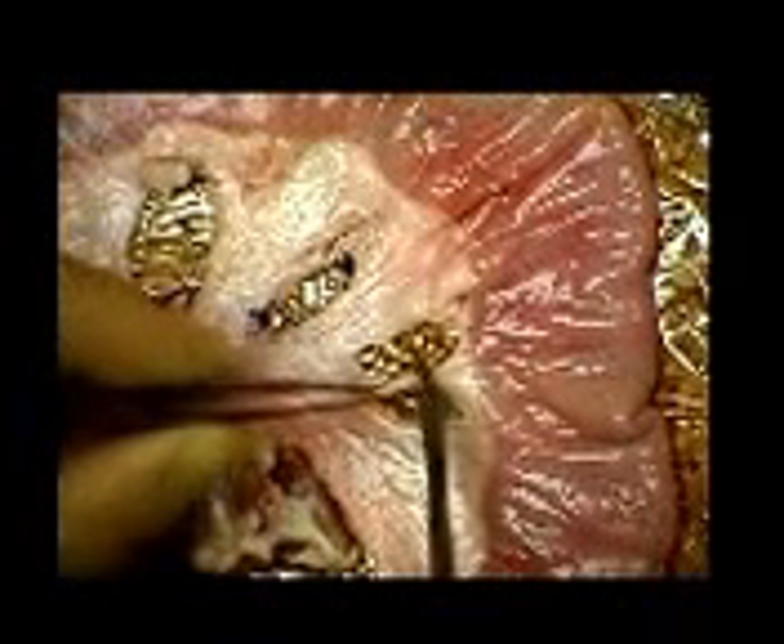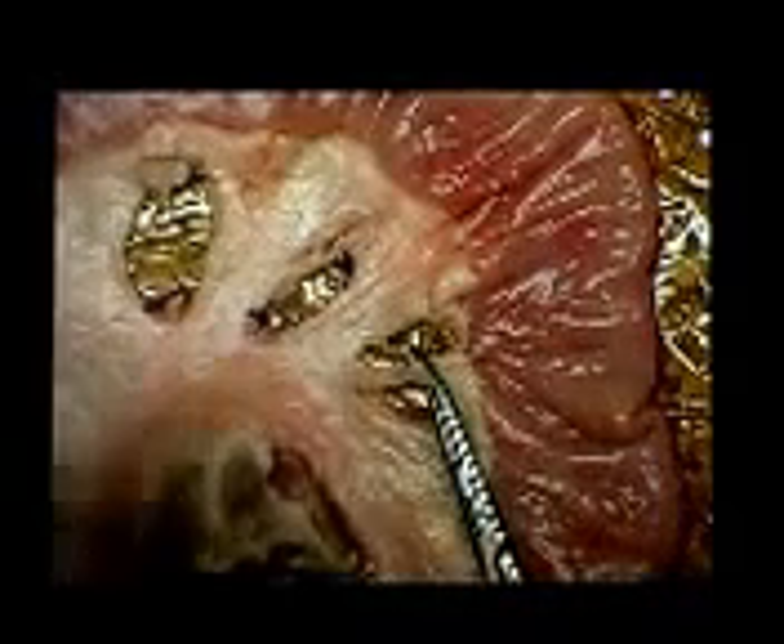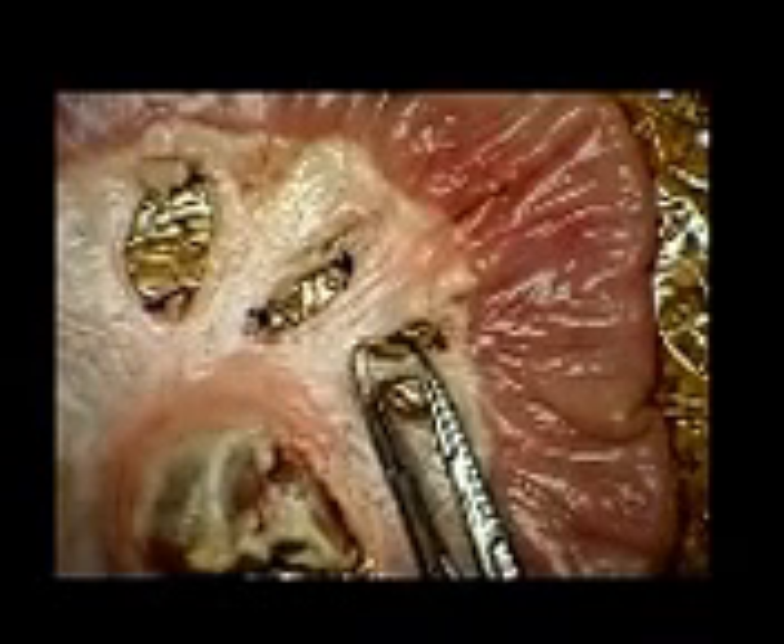The other end of the pedicle is then ligated in a similar fashion. If a pedicle contains a significant vessel, you may wish to transfix the pedicle rather than simply ligating the structure. There are two possible techniques that may be used.